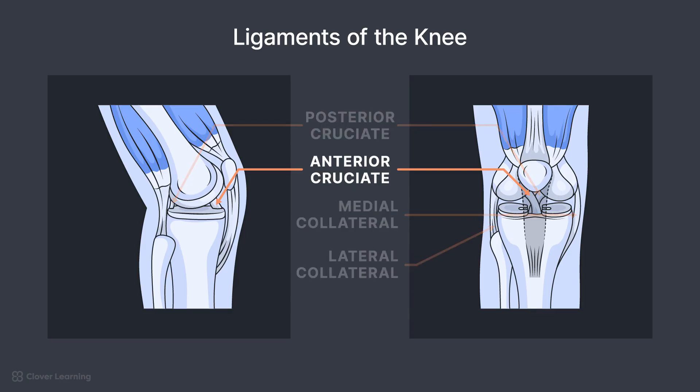The anterior cruciate, or ACL, runs diagonally within the knee and prevents excessive forward movement of the tibia relative to the femur. The posterior cruciate, or PCL, crosses behind the ACL and prevents excessive backward movement of the tibia relative to the femur.